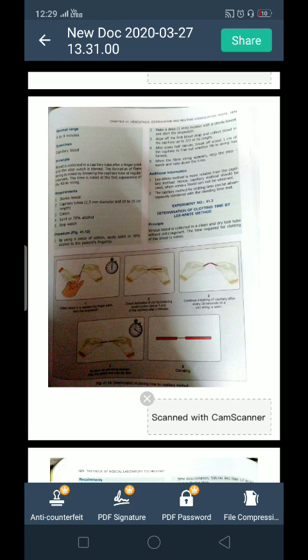the blood with the help of a syringe, and now you will pour it into the test tube and check the formation of clot in the test tube, and this is also known as the test tube method. And the procedure for this method is: in the first step you will collect 2 ml of venous blood, and after collecting the blood immediately start the stopwatch as soon as blood enters the syringe.